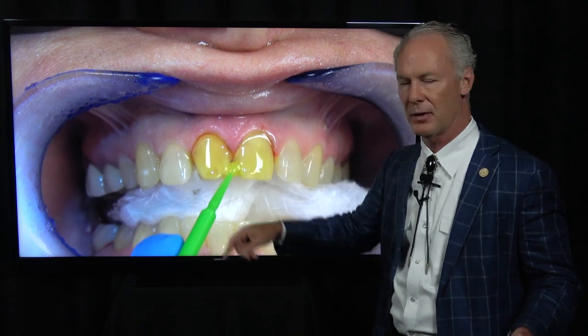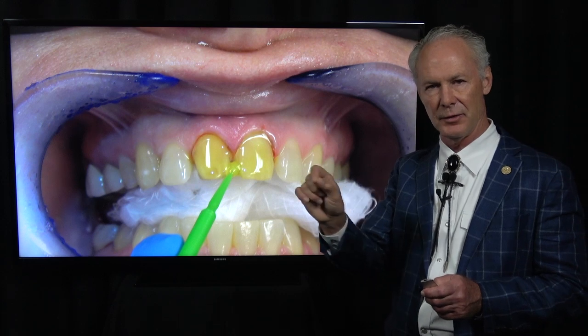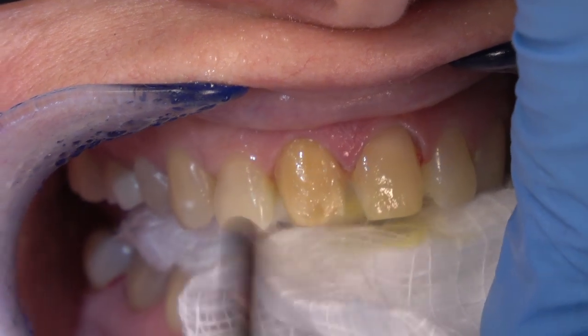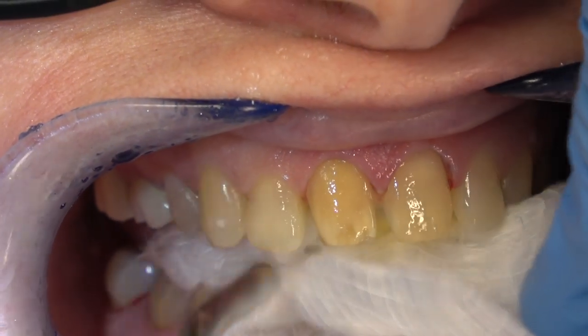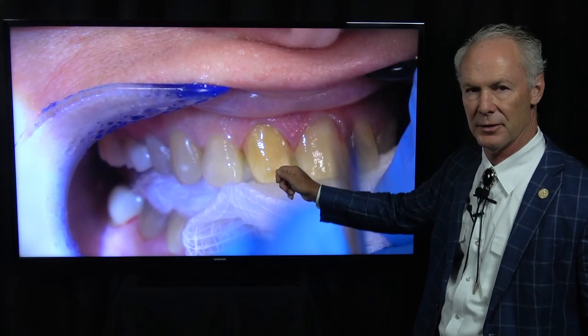See how all the bleeding is controlled with the 38% phosphoric acid — leave it on the bleeding gingival tissue for 45 seconds. Be sure you don't rinse it off with your air-water syringe or you'll elicit bleeding again. Use a large water bottle with a large hole and ice cold water. Then blow all of the primer adhesive off onto a 2x2 placed right next to the teeth — don't just blow it off into the mouth.